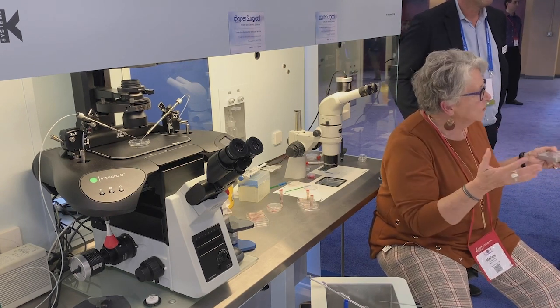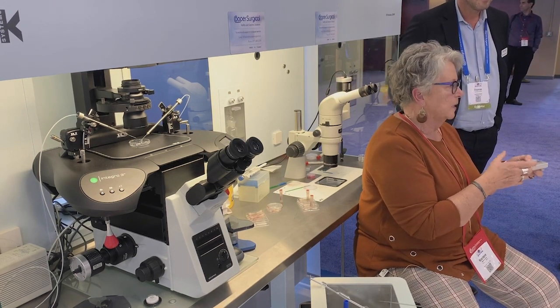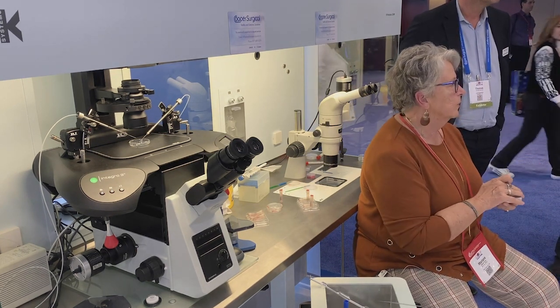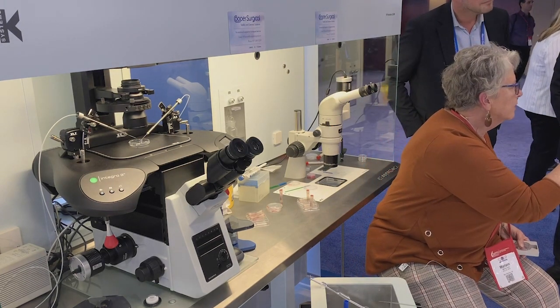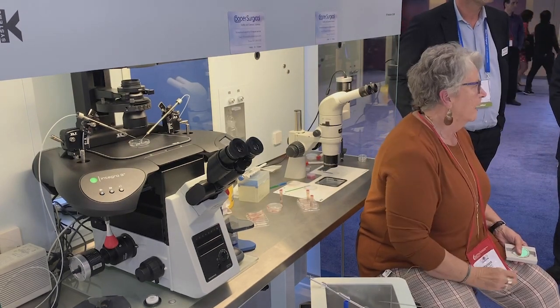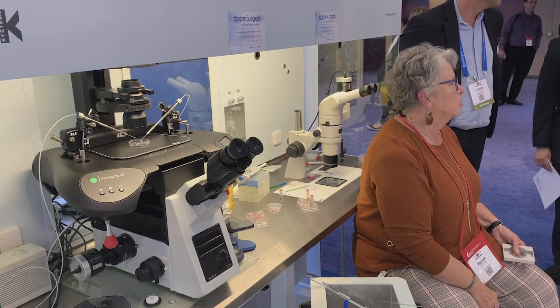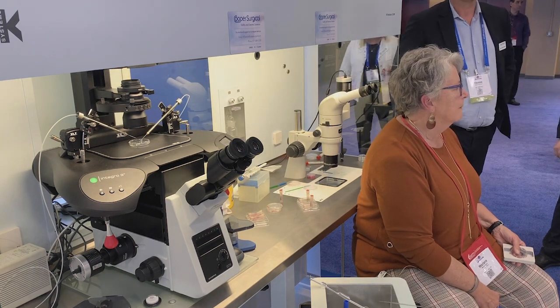Hopefully you figured something out here that you might be doing differently that can help. This is a great thing to come into because it's going to keep your dish warm. And don't pipette. I always check my temperature with a thermocouple. What I do is put a separate water tube into the incubator, and that's what I check. You're right, it would be non-sterile, and I would not stick it into this. I would have it in a separate tube that I measure, because you never know when somebody's going to come along and mess with your temperature setting.